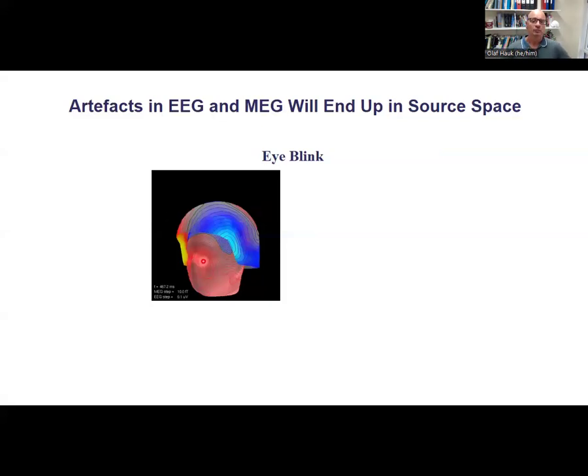So here, if somebody blinks, and this is really just a single eye blink, you get very nice MEG topographies, very symmetrical. The retina is a dipole, so there's a voltage difference between the front and the back of the retina. If you close your eyes, the current will flow. It's a bit like a short circuit. The current will flow, and it will produce this nice positivity here in the EEG centered around the eyes. But this current flow also produces a magnetic field, and this is reflected here in this dipolar topography.